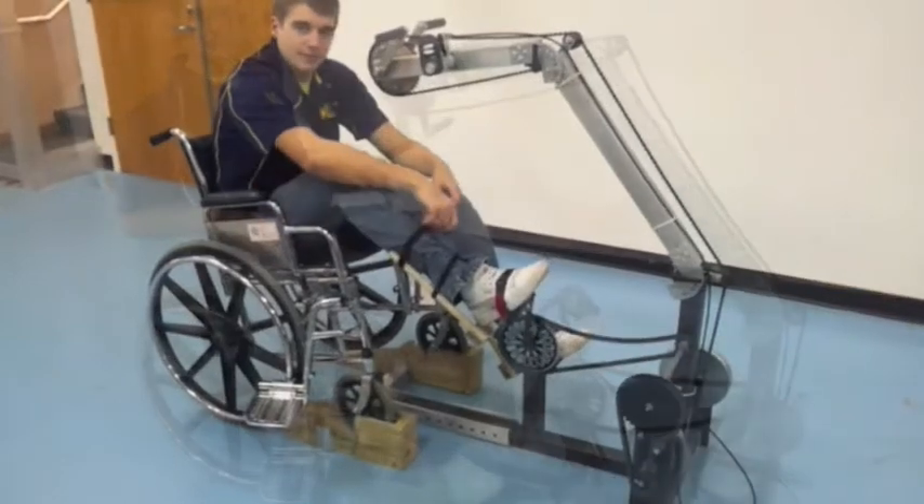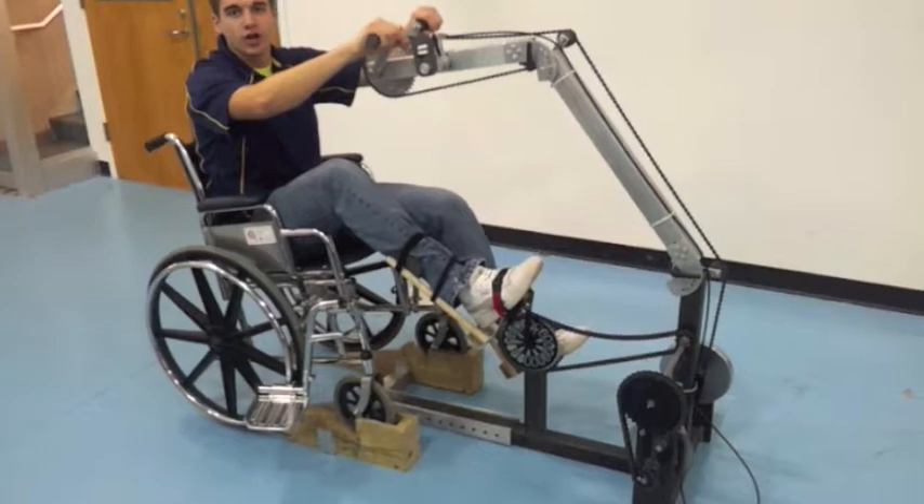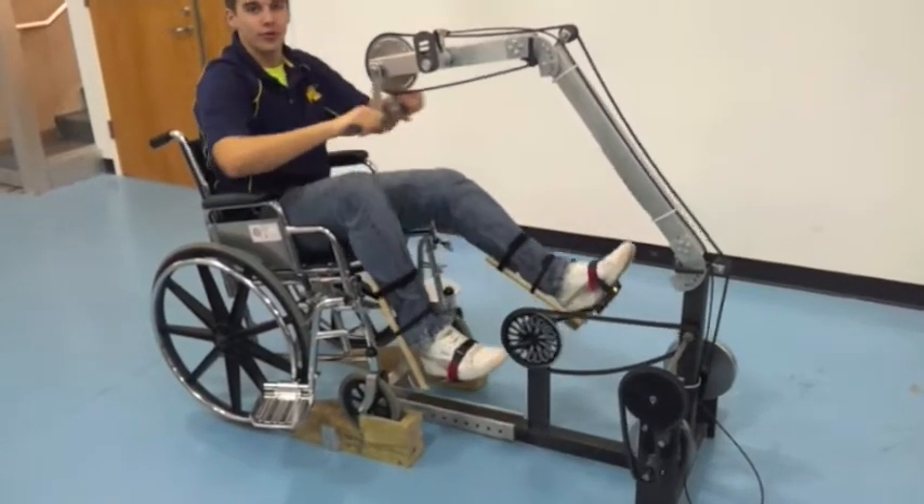Now that I am all strapped into the exercise bicycle, I am going to go ahead and walk you through how it is used. You start off just like any other hand operated exercise bicycle and start working your arms.